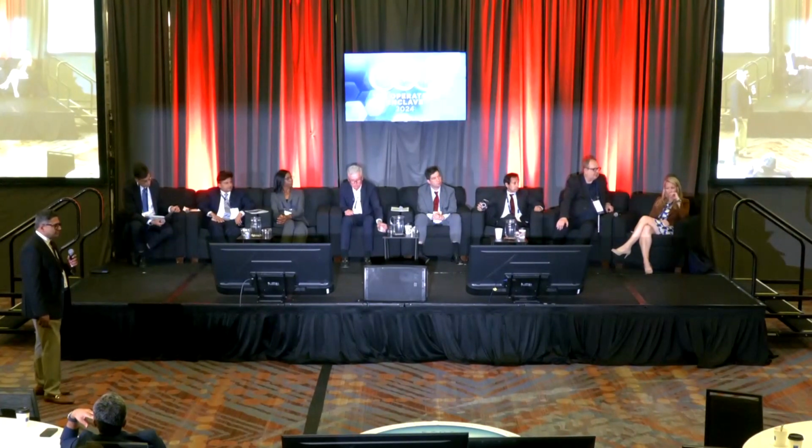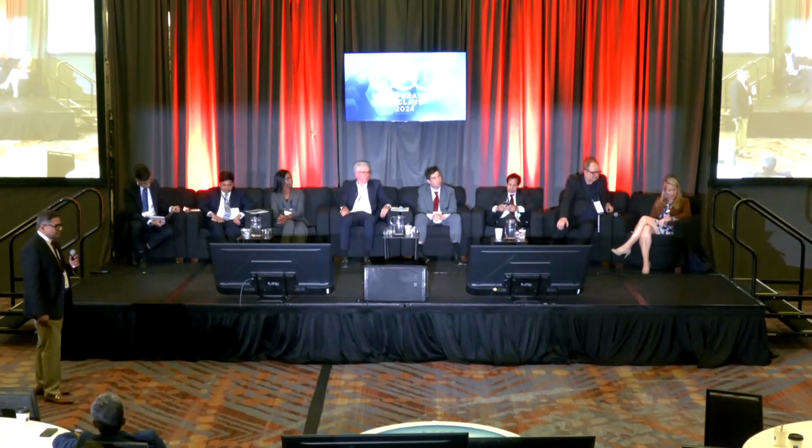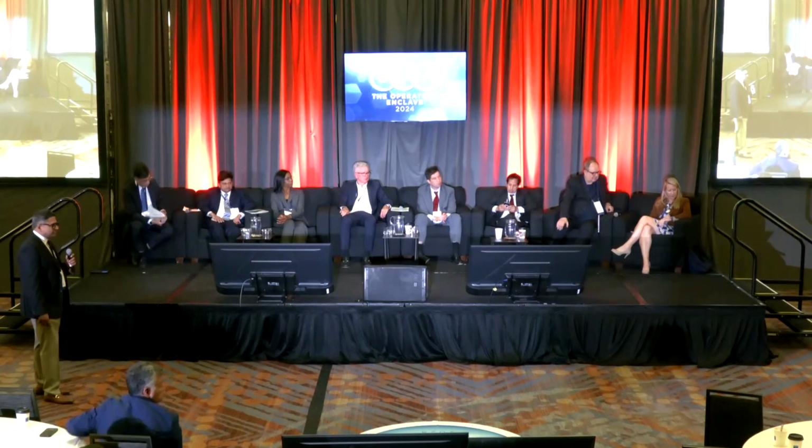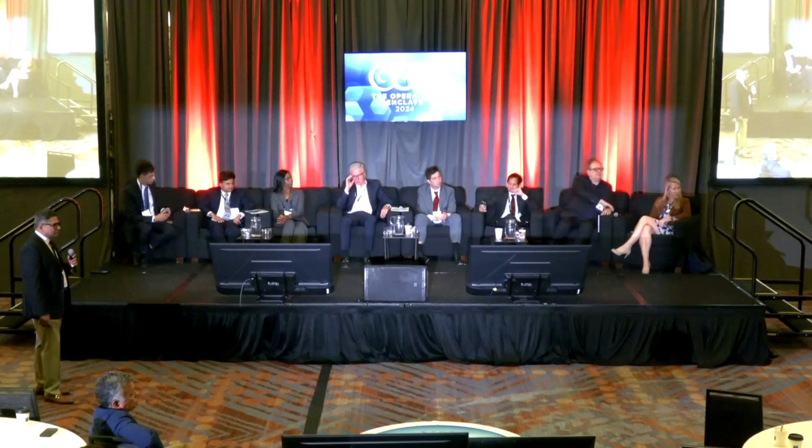But we're always tortured and doing something. But when they're in shock, I think what is reasonable also is to make a trial of self-selection and put in an Impella 5.5 and wait before they improve their kidney function and everything, and then bring them to the cath lab. That has been my approach. I usually don't go early in these cases because I've seen too many expire afterward, despite having beautiful open coronaries, they just don't make it if they're in shock.